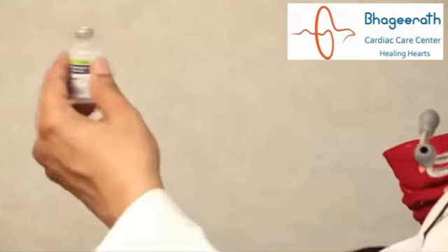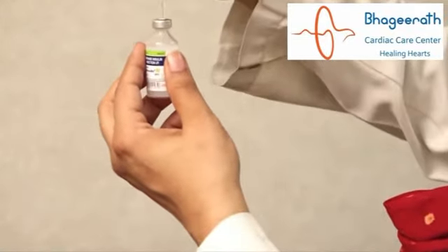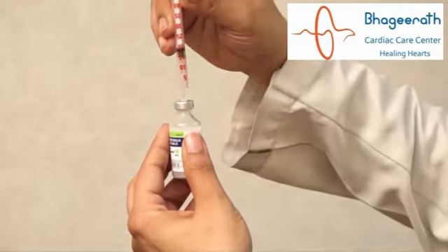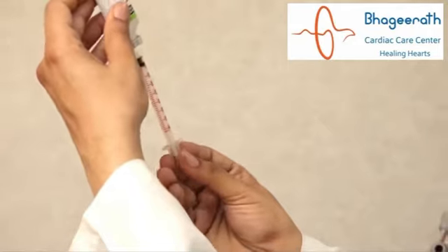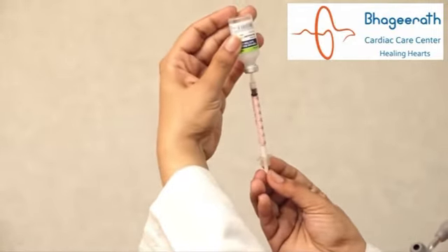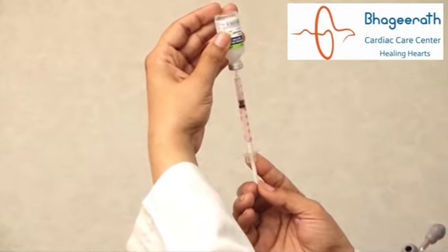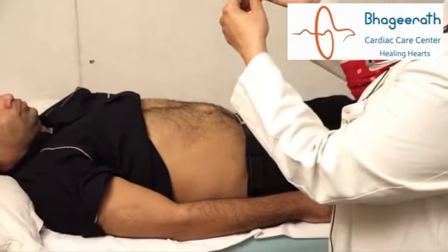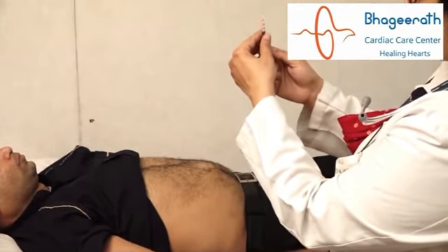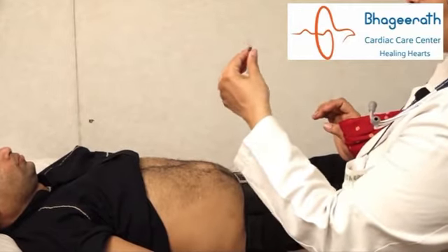the vial. For that you first clean it with a swab and inject 20 units of air to make the pressure stable, and then you just pull the plunger to come towards 20. If there are some air bubbles, make sure there is no air bubble. Just prime it so there is no air bubble. Now this injection is ready to be inserted.